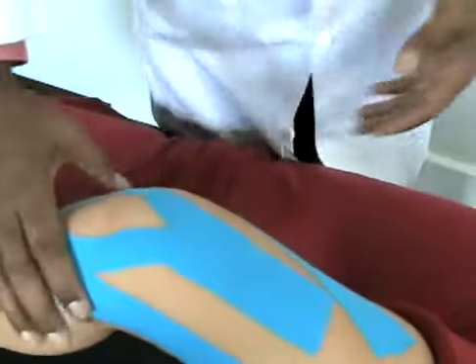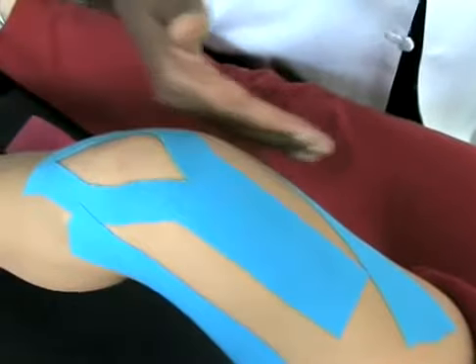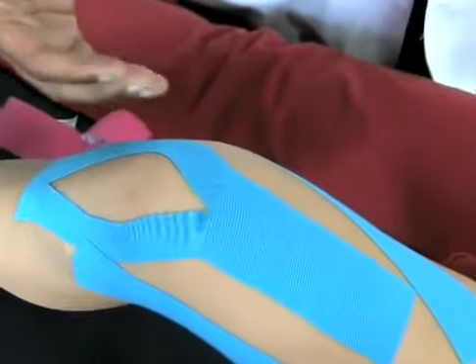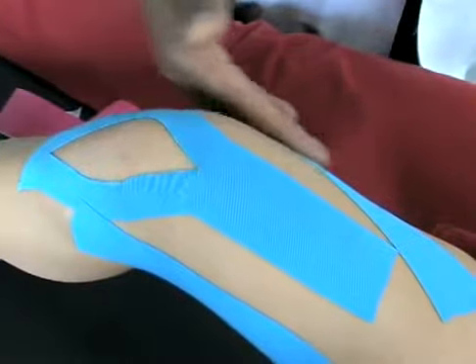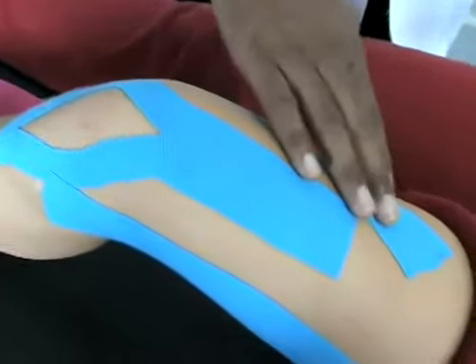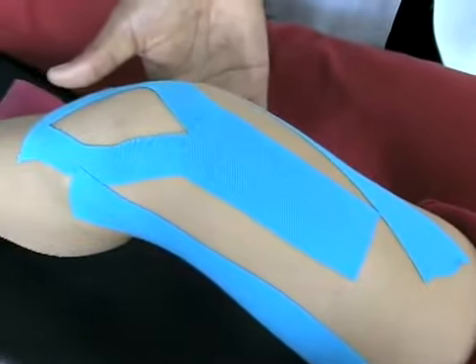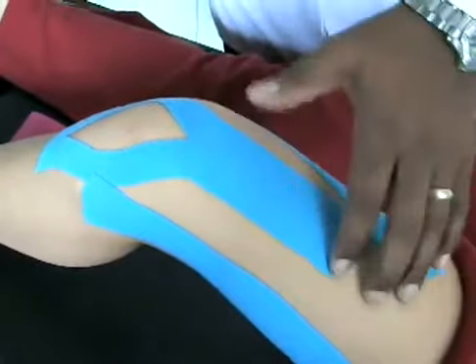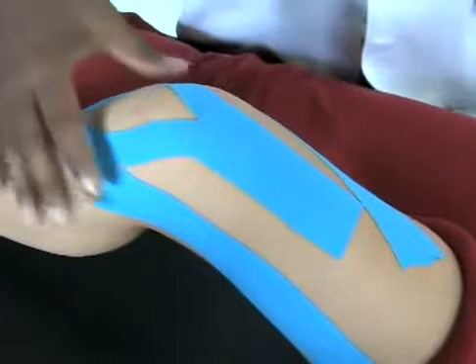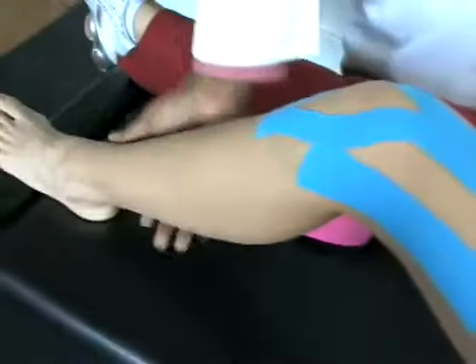We also may have a torn ligament or, again, with a twisted knee, we are going to Kinesio Tape over here. And also, you can Kinesio Tape the hamstring if it's a pulled hamstring, or the quad muscle right through there. Now, we also are going to Kinesio Tape the ankle.